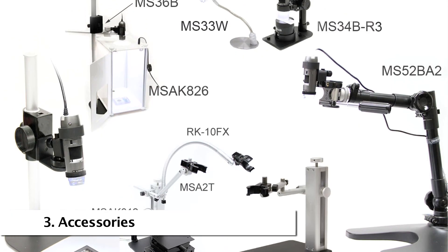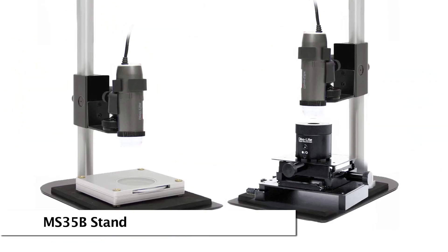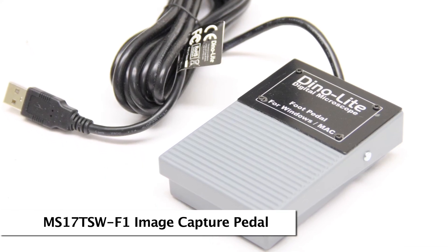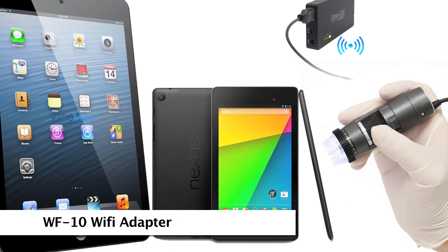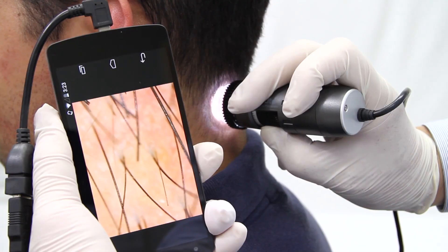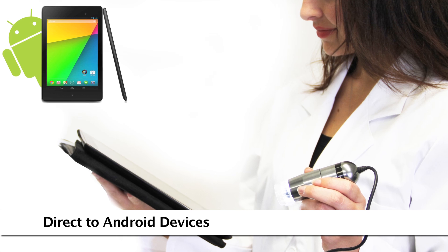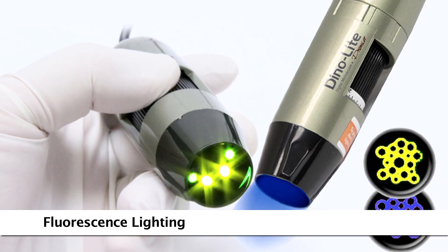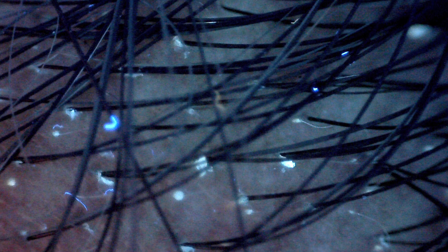There are many compatible accessories to choose from, including tabletop stands to help provide a stable rack for the microscope. Mobile viewing options include Wi-Fi adapters and a direct connect option to compatible Android devices. For applications that require fluorescent lighting, there are many models with different wavelengths available.